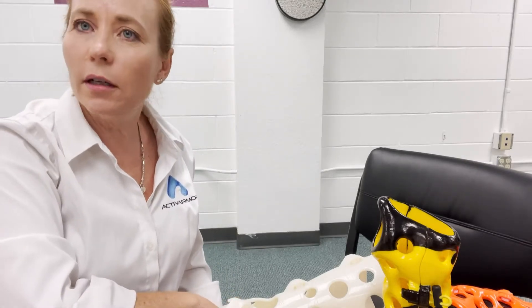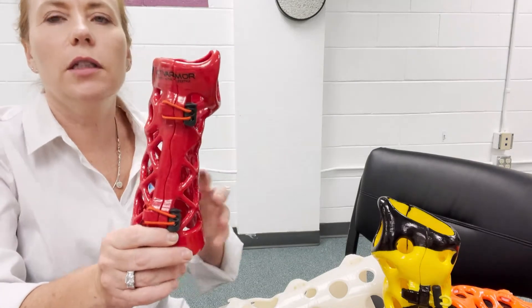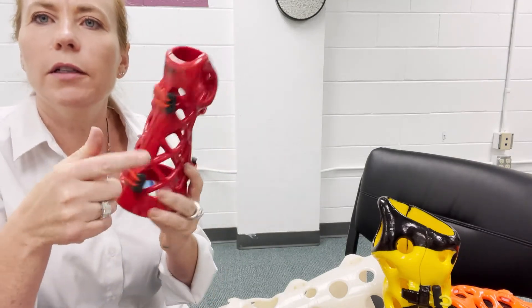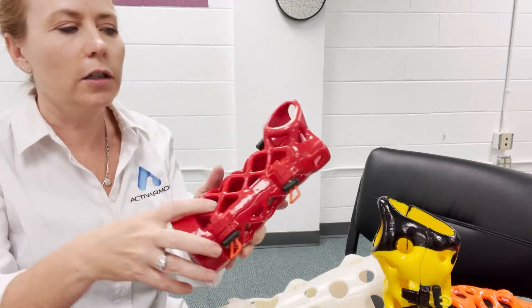I'm going to show you how to put your Active Armor cast on and off. This one is the removable option, like a splint. It's got these little bungees and you can see how it's hooked around these little hooks just like that.